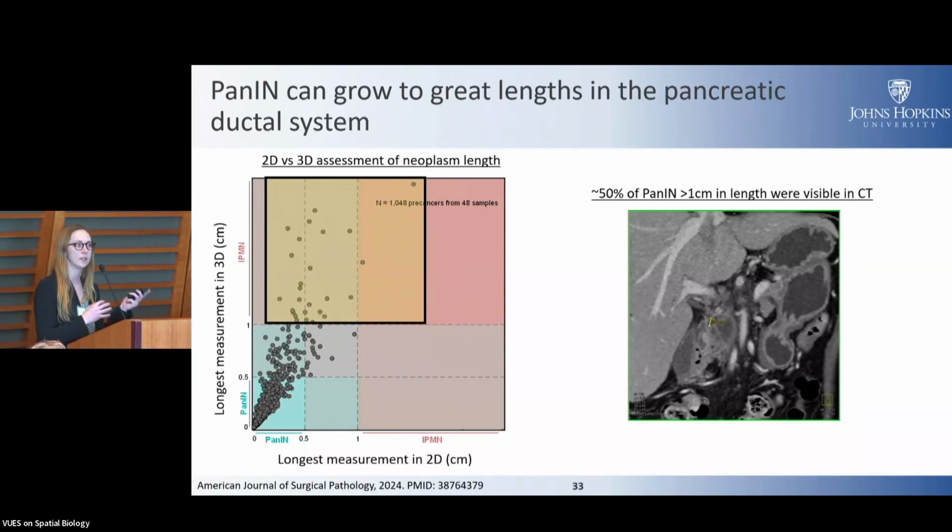So these actually do fit both designations of IPMN, but had been missed in the clinic because the medium used to diagnose them, H&E, fails due to the fact that you don't know what angle you section tissue at.